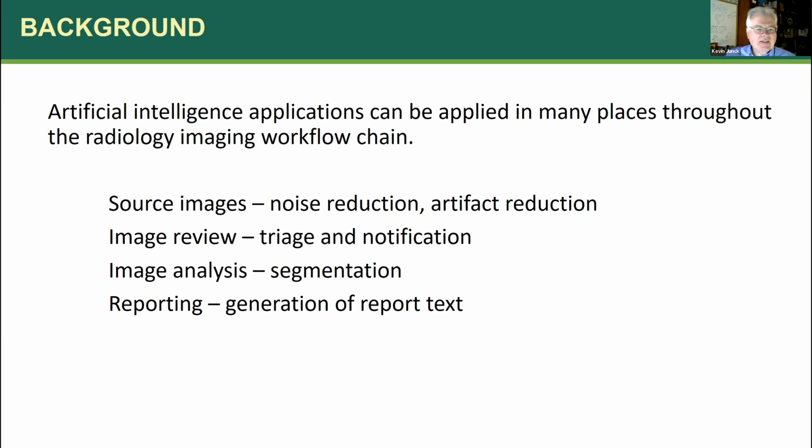The big thing that gets the buzz and that we see on the news and we see articles about and at all the conferences are, hey, I've got this AI algorithm and I've trained it on these sorts of images and it can detect this particular clinical finding as well as a radiologist. And that's what gets all the buzz. But really, artificial intelligence applications can be in use throughout the whole pipeline.